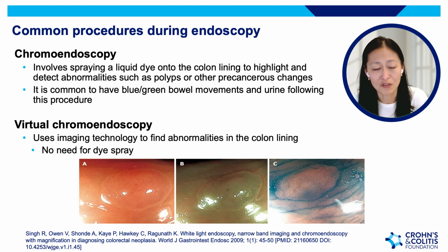Other common procedures during endoscopy include chromoendoscopy. Chromo literally means color. So you're using techniques to improve imaging so that your doctor can see better inside.